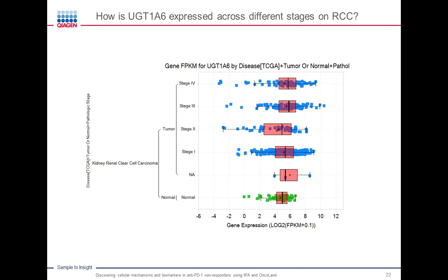Yes, it is very easy within the software. You can subgroup things into different stages, as you can see over here. So now tumor row is split into stage 1, 2, 3, 4, etc. And again, difference-wise, we see some difference, but the difference is not that great. I mean, there's some difference between stage 1 and 2, 2 and 3, etc., but it's not that great.